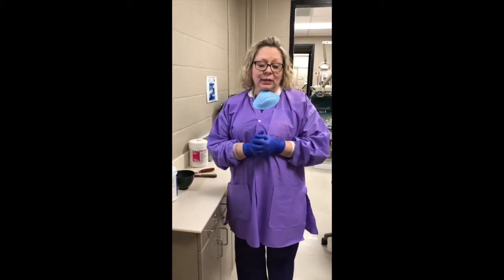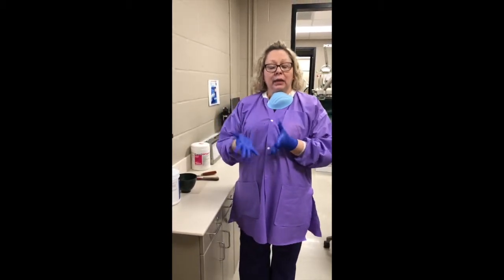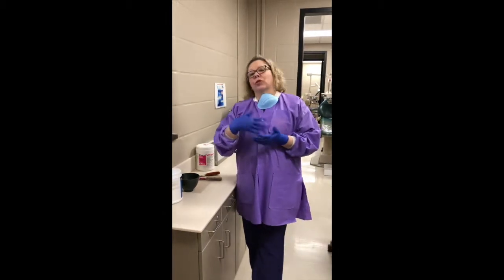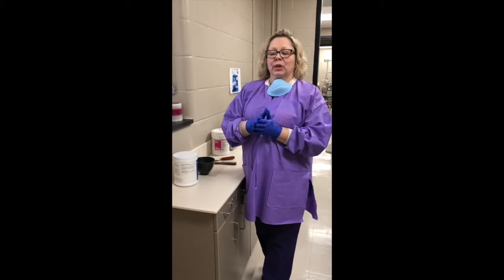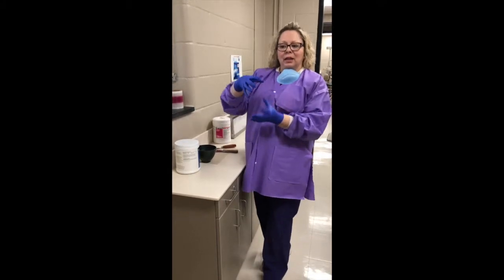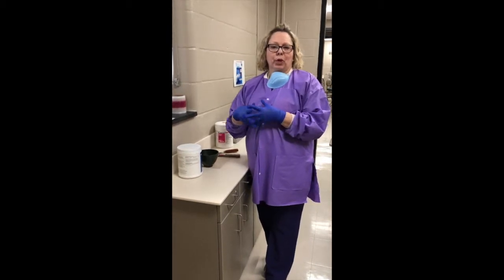One of the primary reasons is if a patient comes in and they have extensive decay or broken teeth, we can take an impression of their dentition and create a study model that the dentist can then look at after the patient's no longer there to help analyze his treatment plan. Sometimes when you have an extensive treatment plan, you can't do it at the moment the patient is in the chair. You have to study it, compare the way their teeth bite together, and how you can present to the patient the best restorative options for them.